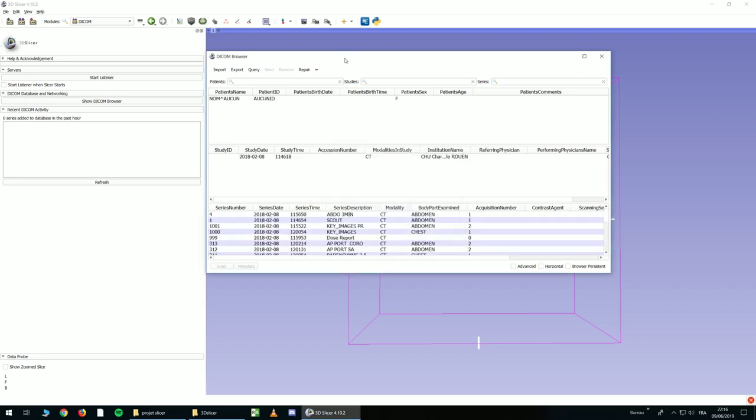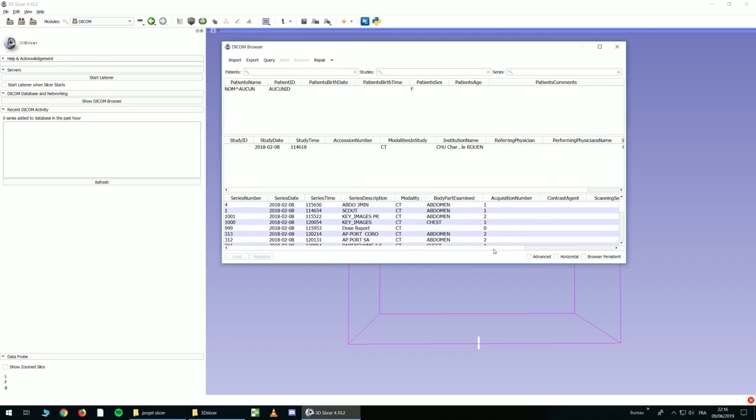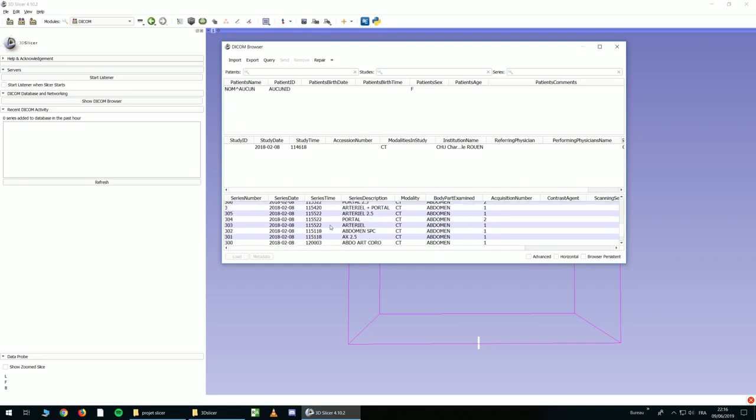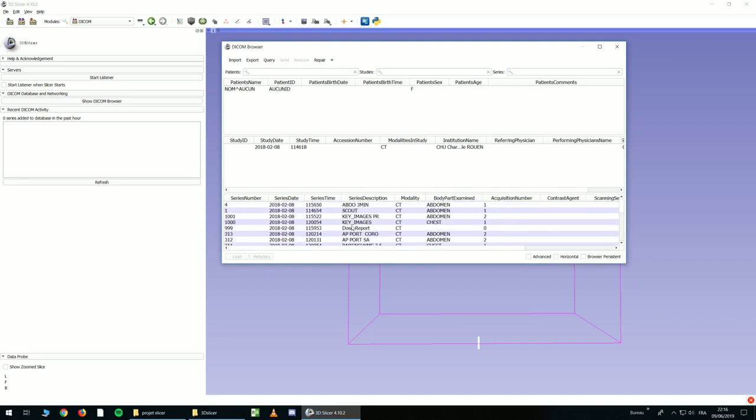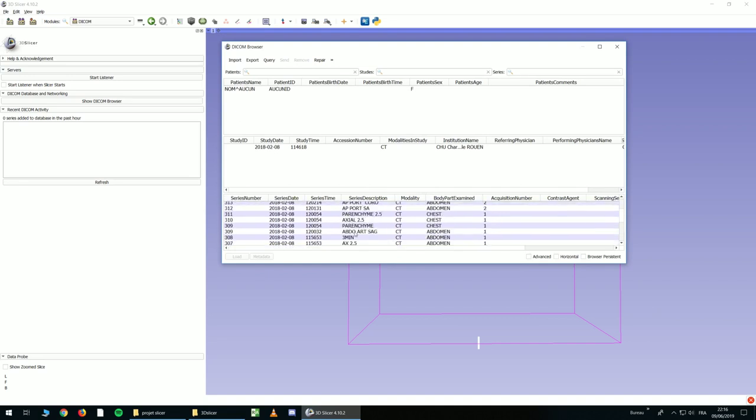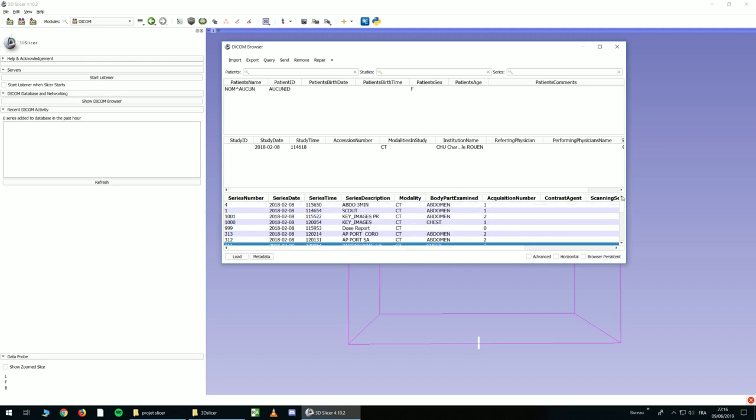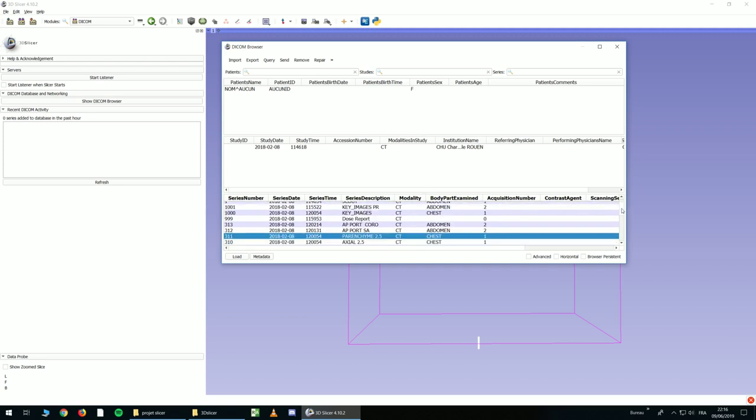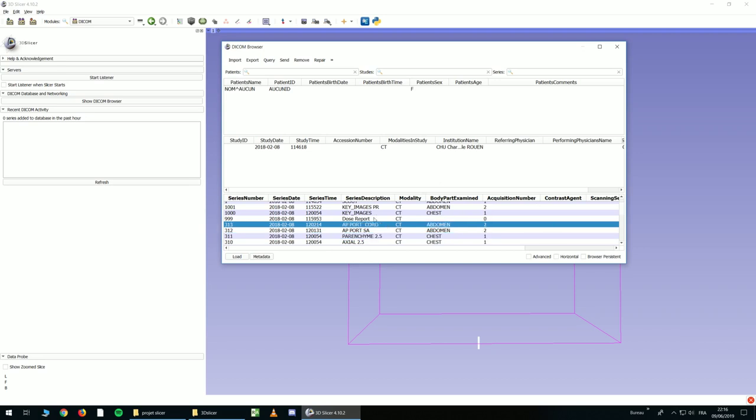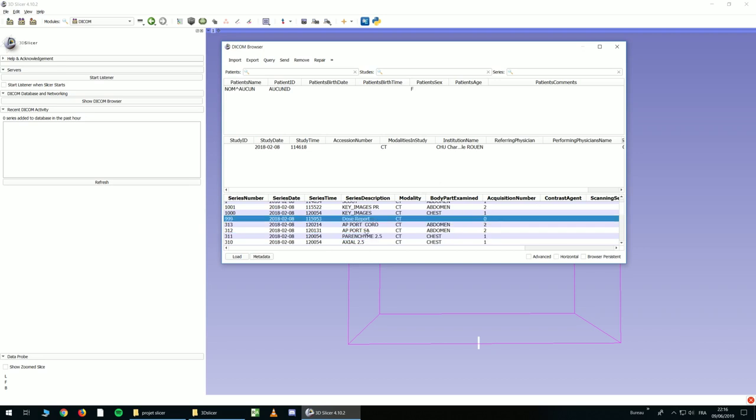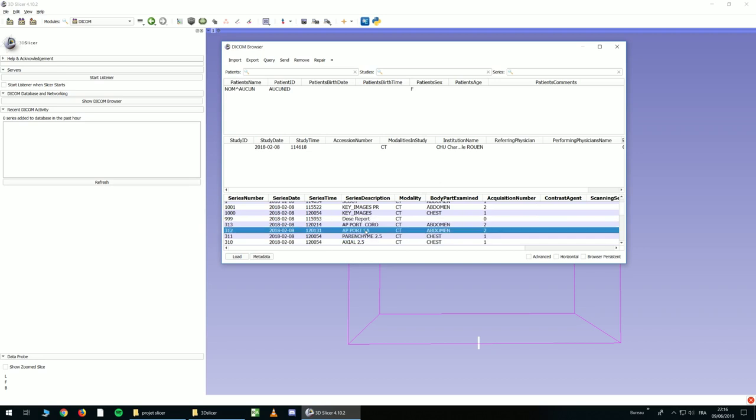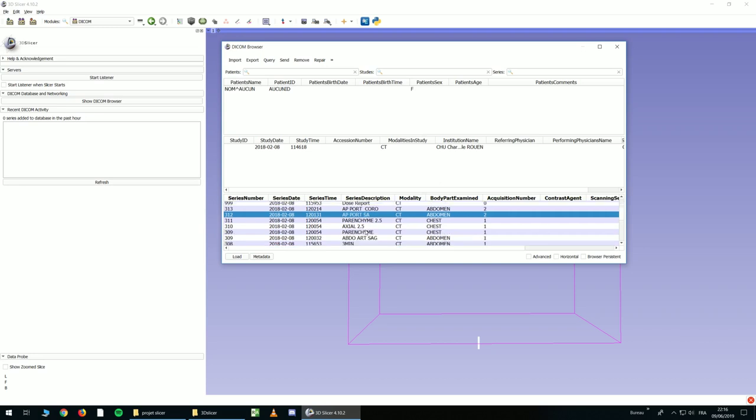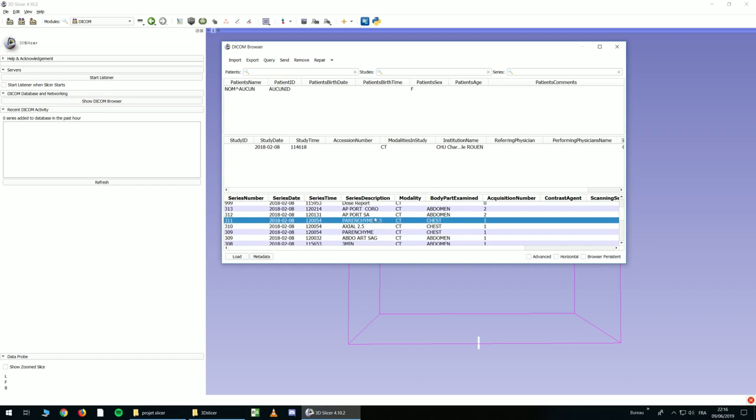Now you have to choose the right exam. It depends what you want to do. If you want to do something precise with, for example, vascular reconstructions, and you need precise idea of the anatomy, you should use one millimeter slices, but everything will take a little bit more time.